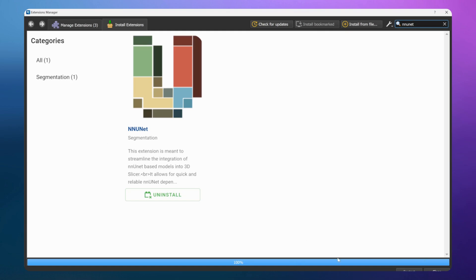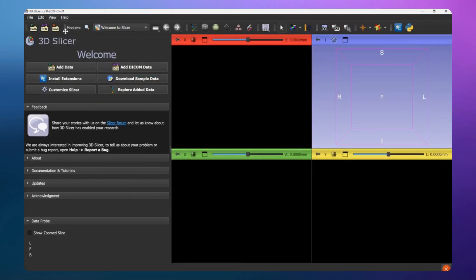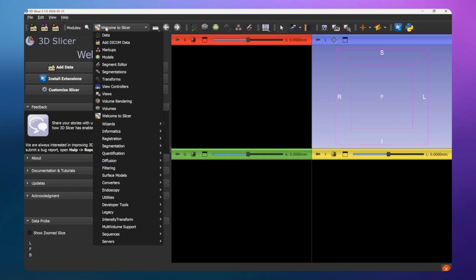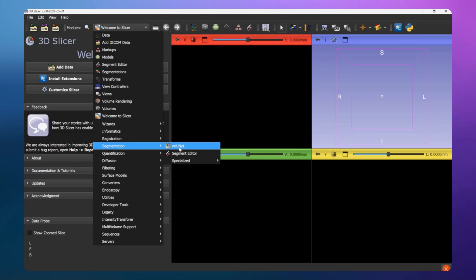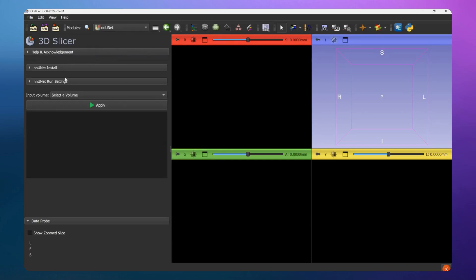Once installed, go to the extensions that are already installed. You will find the NNUnet extension under the Segmentation group. When you go to Segmentation you have the NNUnet extension - click on it. It is very easy to use. Thanks to the team that built this extension and made it free and open source.